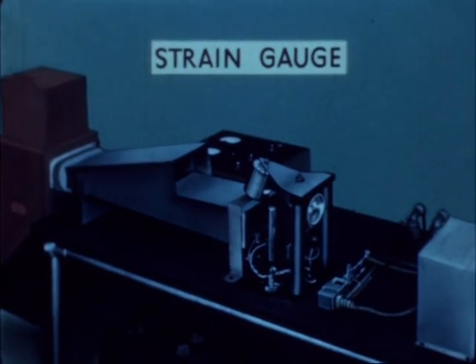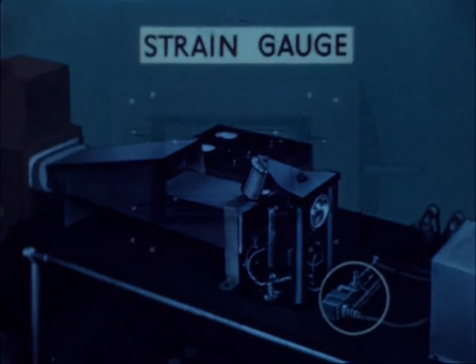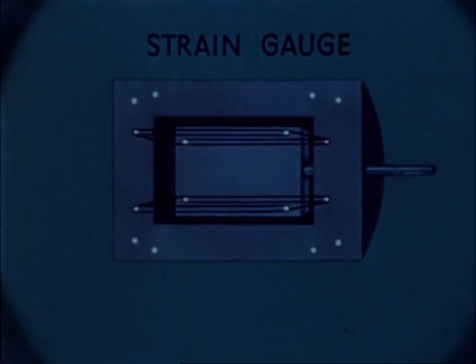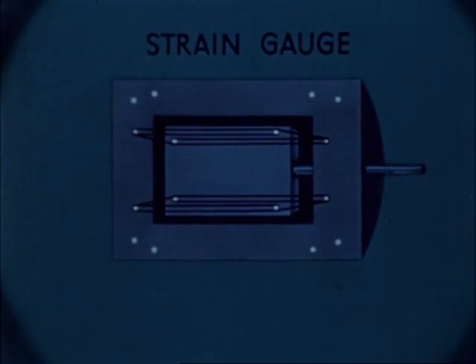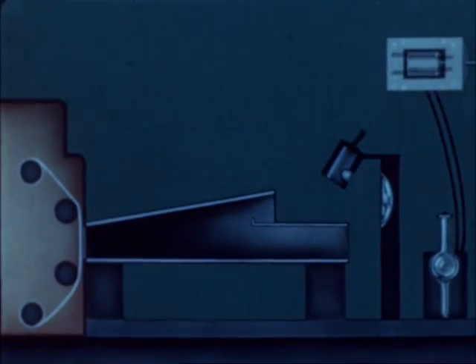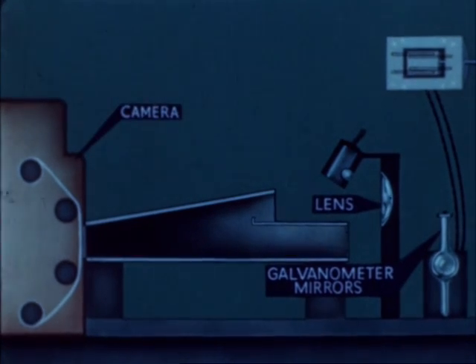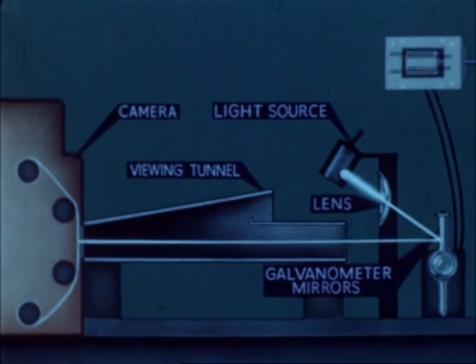This consists essentially of a special type of wire which alters its electrical resistance when stretched. The stretching movements are, of course, grossly exaggerated in this illustrative diagram. Changes in resistance produced by pressure are used to deflect the galvanometer mirror using the Wheatstone bridge principle. These deflections are recorded on moving photographic paper.